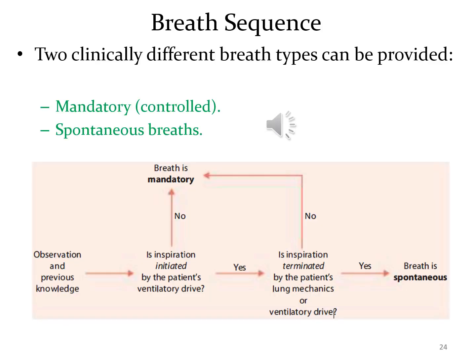Breath sequence. Two clinically different breath types can be provided during mechanical ventilation: mandatory controlled and spontaneous breaths. A spontaneous breath is both initiated and terminated by the patient.